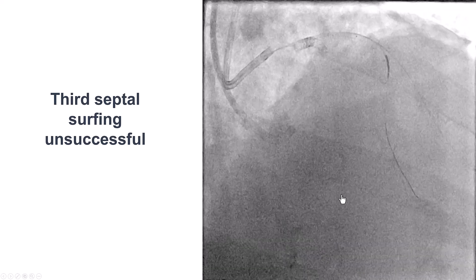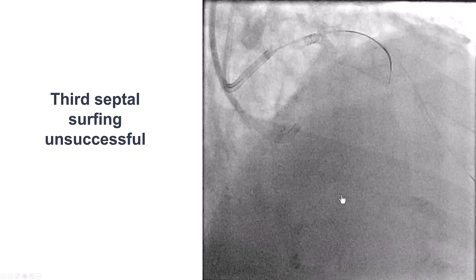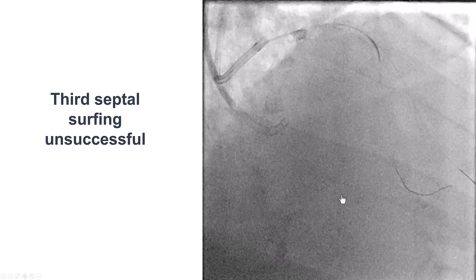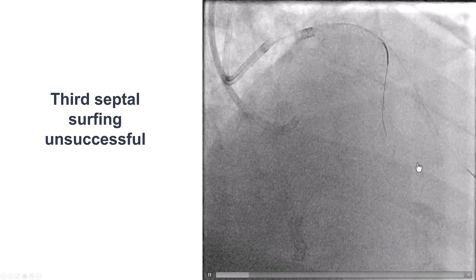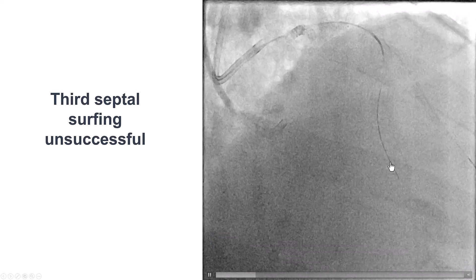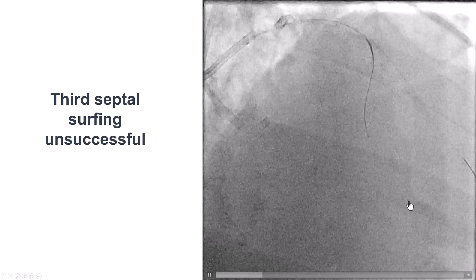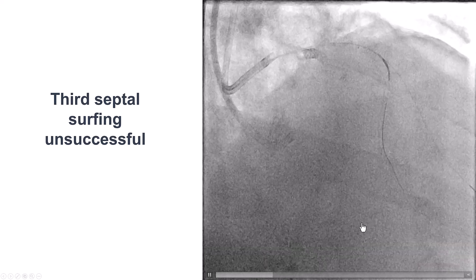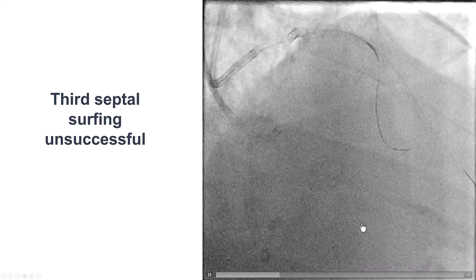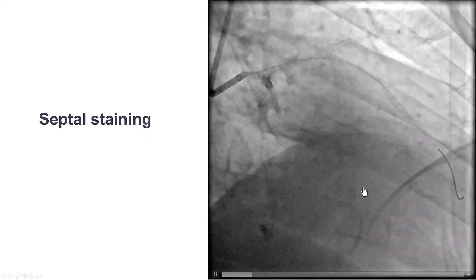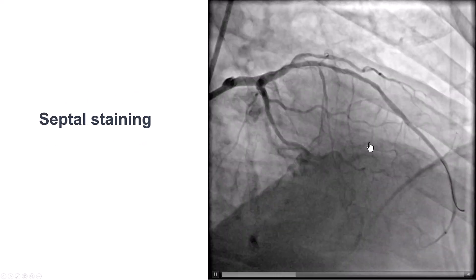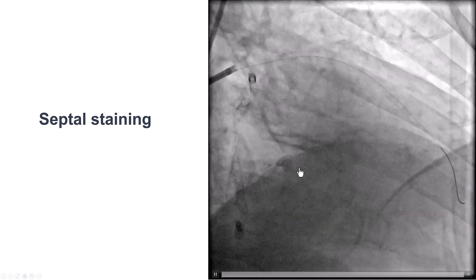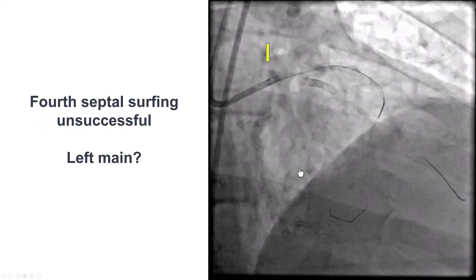We then switched to another collateral. We did surfing through the third septal collateral, but once again the wire seemed to be going in a different orientation — going more towards the apex — and it would not take the bend back towards the right coronary artery. After multiple attempts, we pulled the wire back and actually saw that there was some staining from the previous attempts to cross through the septal collateral.